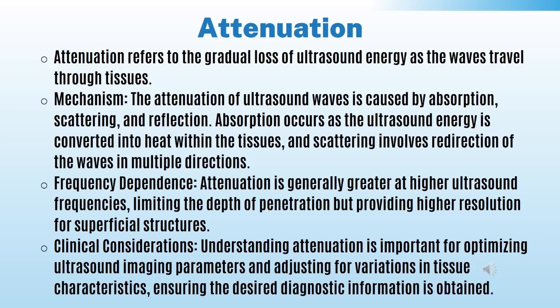So as we stated before, the higher the frequency, the less depth of penetration you're going to get, but more resolution. So the image will be very clear and crisp the more shallow you go with a high frequency transducer, and vice versa for low frequency transducers. Clinical considerations would be understanding that attenuation is important for optimizing ultrasound imaging parameters and adjusting for variations in tissue characteristics, ensuring the desired diagnostic information is obtained.